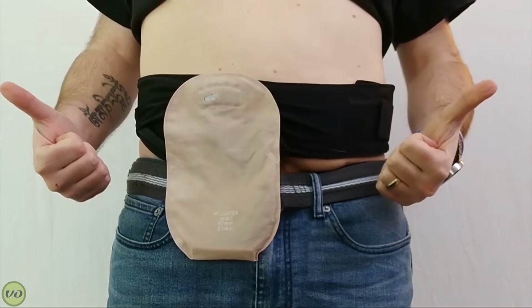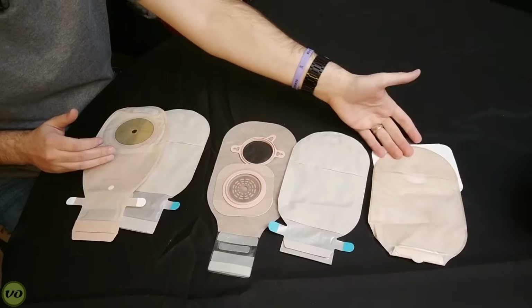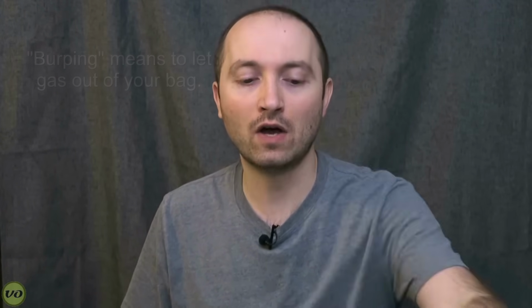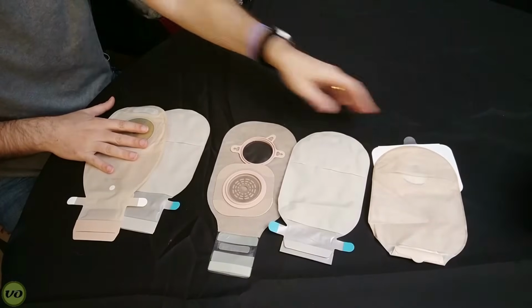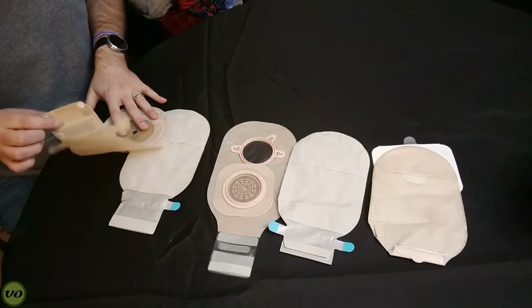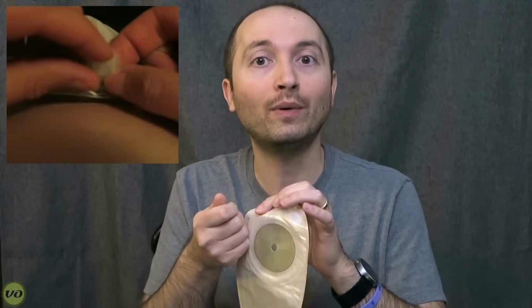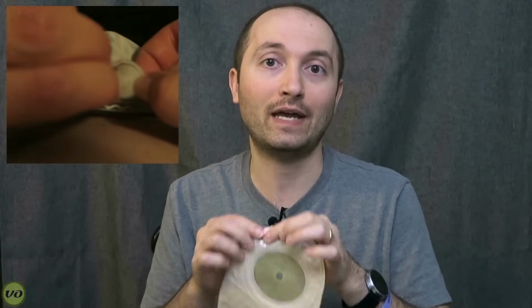Now, as with the one-piece system, the two-piece system with the adhesive coupling is not a system you want to use if you like to burp your appliance. If you like to burp your appliance on either the one-piece or the adhesive coupling two-piece, I would suggest either doing it from the bottom of the bag, which can be a little risky, or going with something called the Osto Easy Vent, which is actually a product that you would attach to your bag, and it's basically a vent that you can open up. Gas will escape and then you close it up again. So that might be one option if you like to burp your appliance or if you have a lot of gas that isn't effectively being removed by that filter.